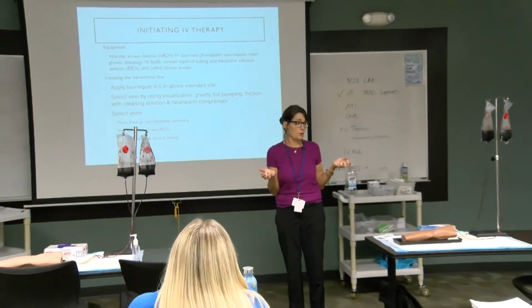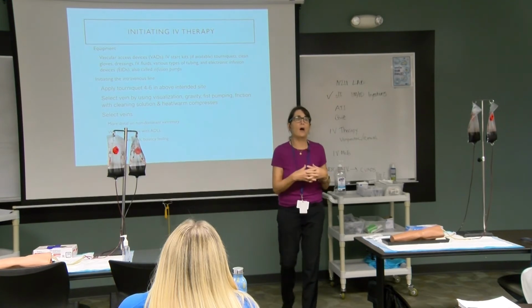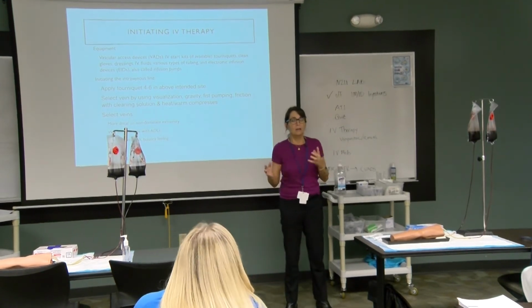Getting back to talking about initiating IV therapy. So first of all, do we need an order for an IV? Yes. Does anybody remember how IVs are typically ordered?